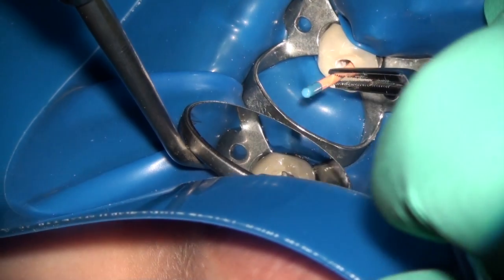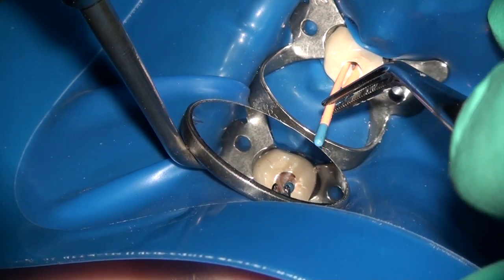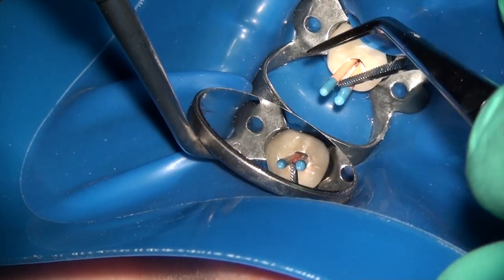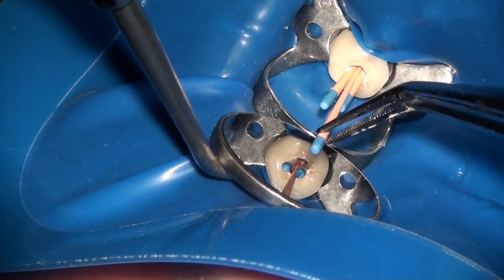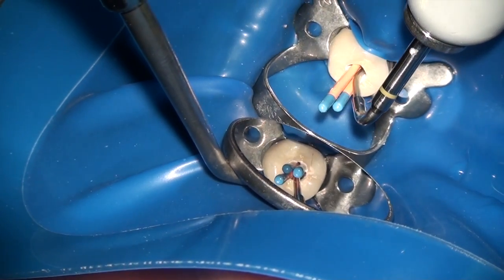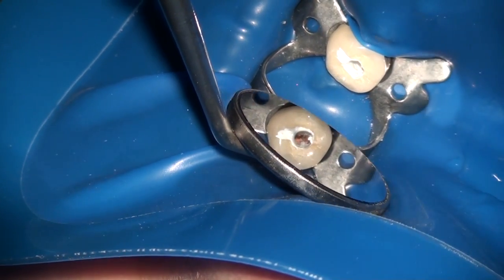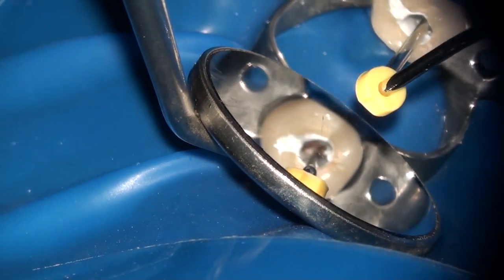Once the sealer has been applied, the three EndoSequence gutta-percha cones that correspond to the EndoSequence rotary files are now cemented into place. It's very important at this point to visualize the orientation of each canal deep inside the tooth, so that you can place your cones and slide each into that particular canal. The EndoPro 270 is then used to sear off all three cones simultaneously in the mid-root area. A nice trick is to leave the EndoPro in place and have your assistant pull out the cones — this prevents any pulling out of the cones.